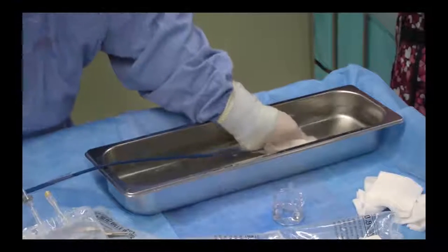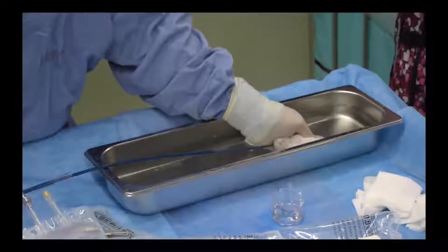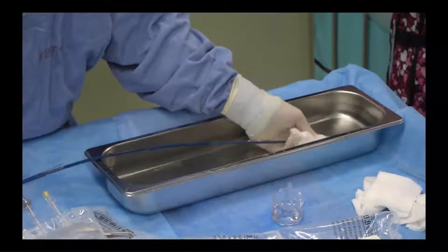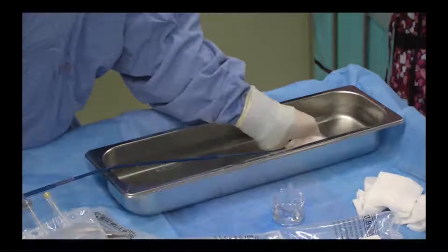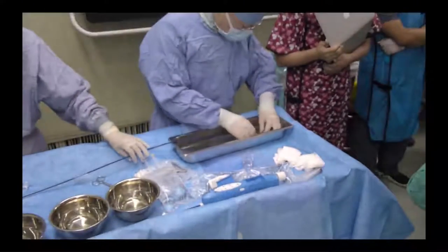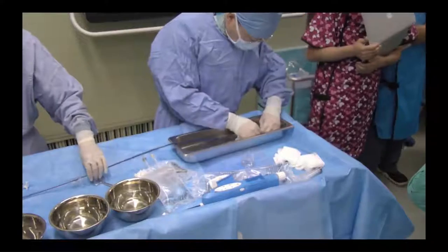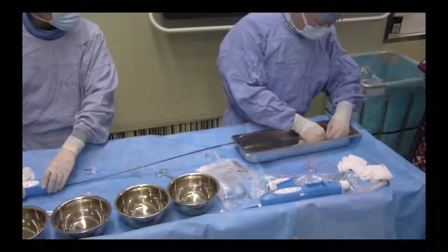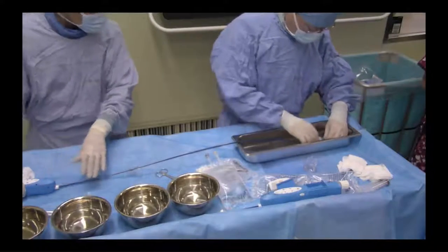But it's a bit like a screwdriver, and electrical screwdrivers work very well. You have a variable torque, how much you need to pull back, and measuring distance, some way to be intelligently pulling it back. I think potentially that doesn't mean that the new systems will work as well as electrical screwdrivers, but there's a rationale for it.